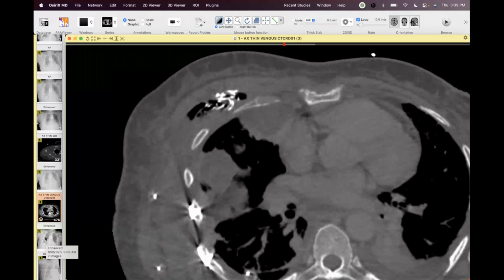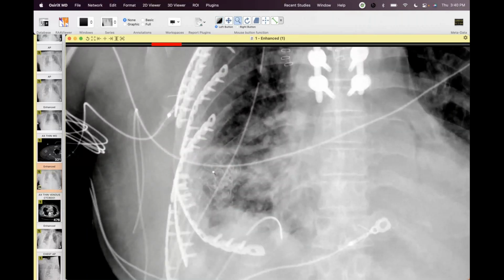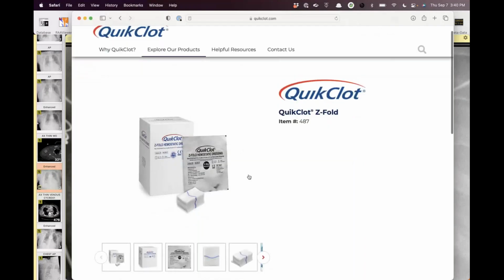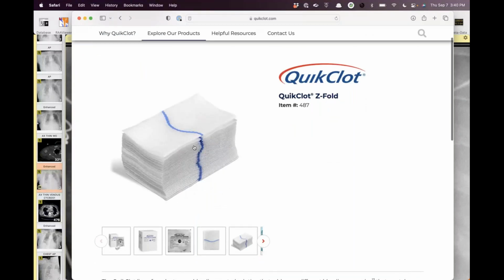And I'm curious if any of you have seen this before. No. No. It's called QuikClot. And I can show you a picture. Do you guys see this web browser? Yeah. So this is what it is, and it comes as this one way it's distributed like this. This is basically like 3 or 4 yards long, and it's the Z fold, so it folds. And I think this is the only radiopaque marker on it.